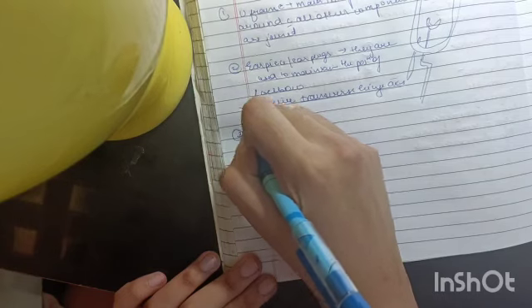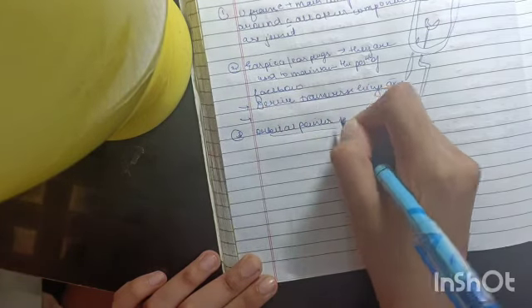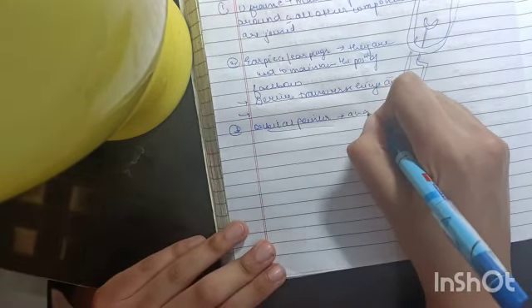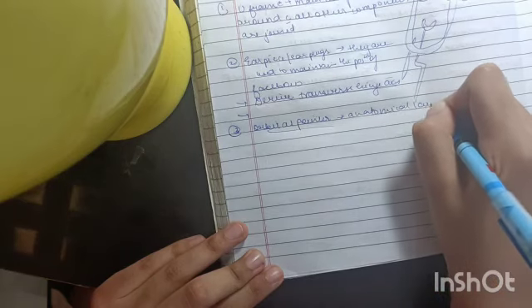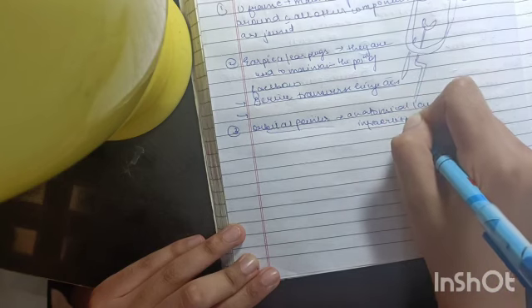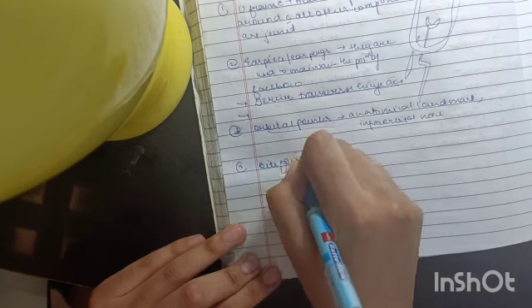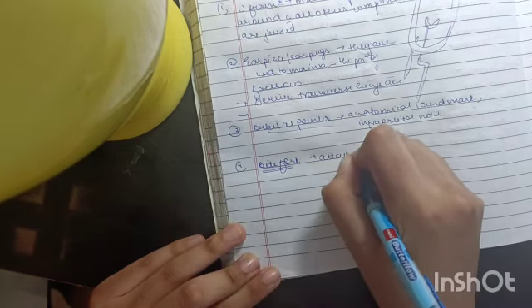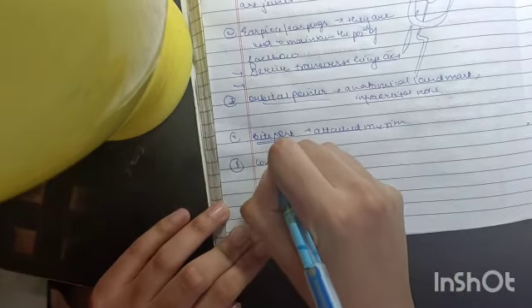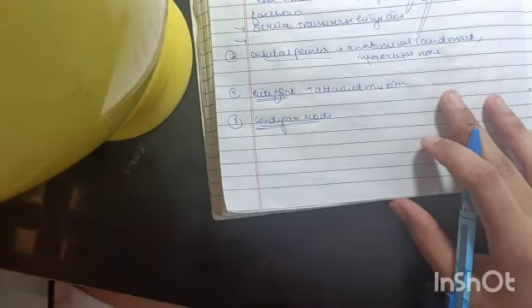Third is the orbital pointer. This is used to derive the anatomical landmark, that is the infraorbital notch. Then we have the bite fork. This is attached to the maxillary rim. Then fifth we have condylar rods. Alright, now these are the components of face bow.